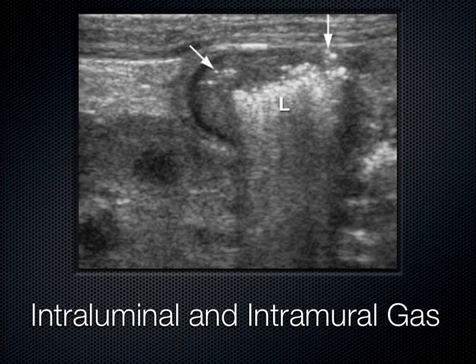Here's an example of a mixed picture. We see intraluminal gas, which is normal. Everybody in this room right now who's ever had a fart has intraluminal gas. That's normal to see. We'll see that all over the models today, hopefully.